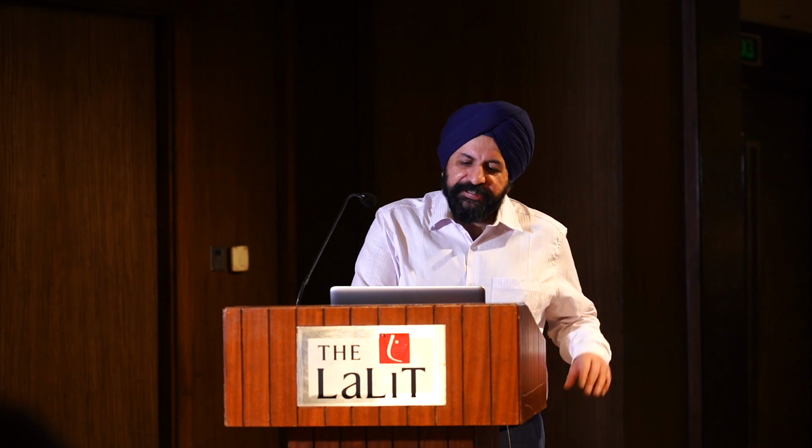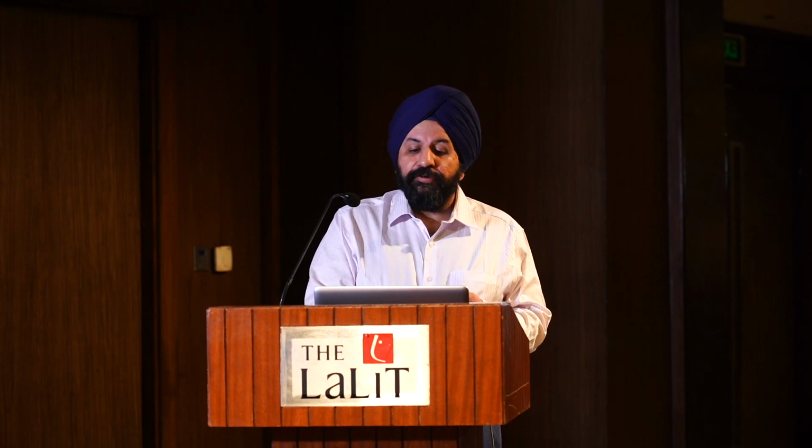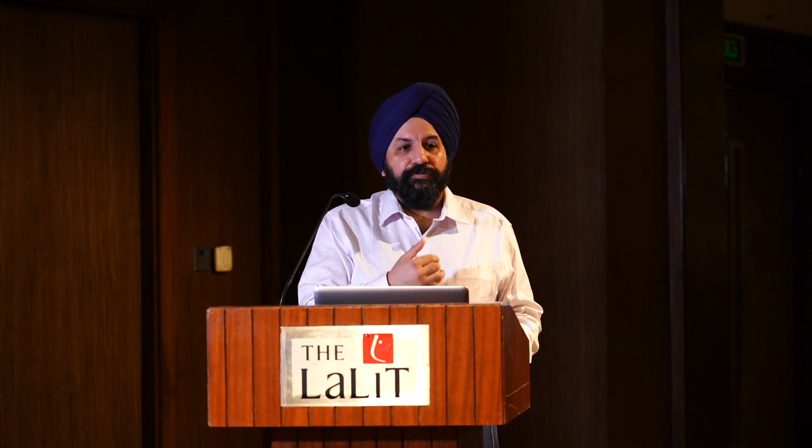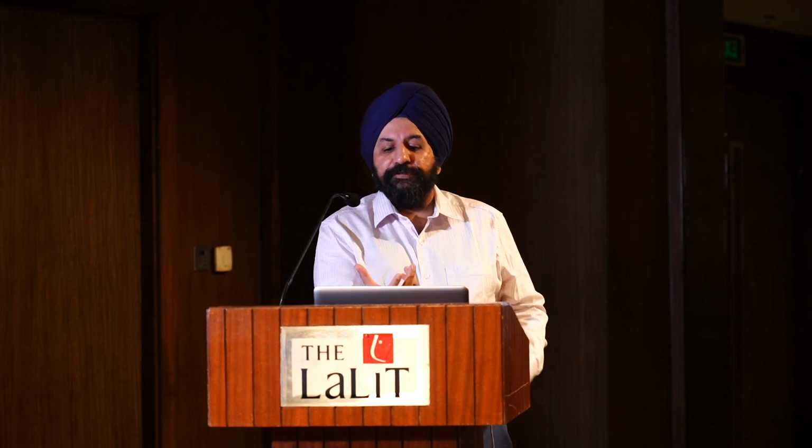This is the third paper that we presented at ISLH Vancouver 2019. Clinical evaluation of various predictive markers of platelet recovery in dengue patients. So here what we did was, instead of just focusing on IPF, we brought everything to the table. So we looked at mean platelet volume, we looked at IPF, we looked at high fluorescent IPFs, we looked at the high fluorescent cells, HFCs, that we discussed before. We also looked at neutrophil lymphocyte ratio, platelet lymphocyte ratio, and platelet HFC ratio.